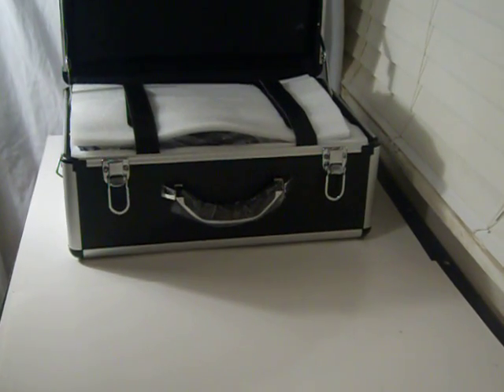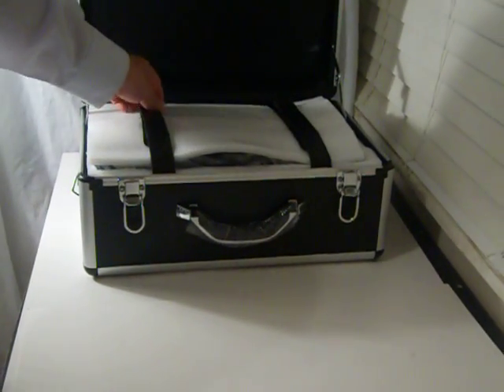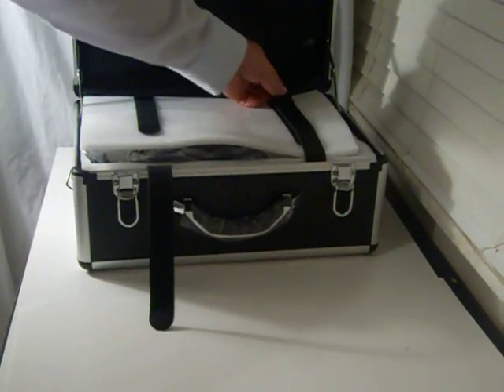The ultrasound scanner comes in a very nice carrying case, as you can see. It's very easy to prepare for work.